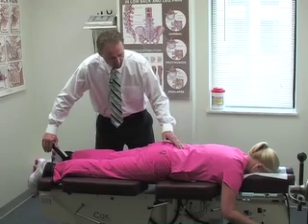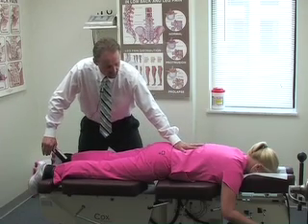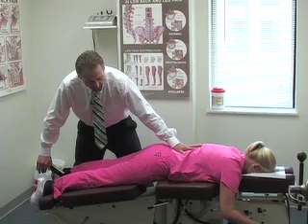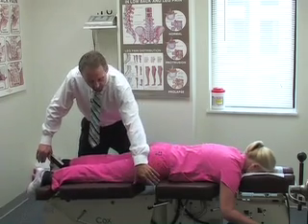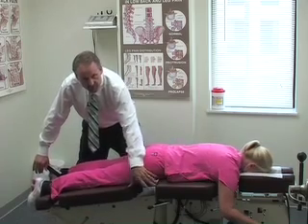What we do is utilize the fact that the table is hinged in the middle and apply flexion to the spine, and then mechanically distract or elongate the table. As you can see, the cushion's coming apart here. The same thing is theoretically happening to the segments of the spine.